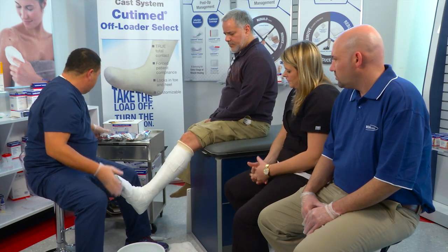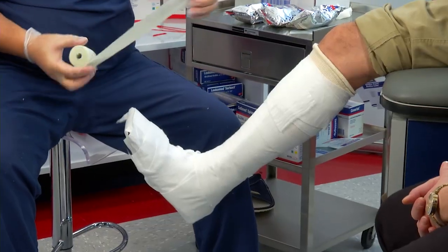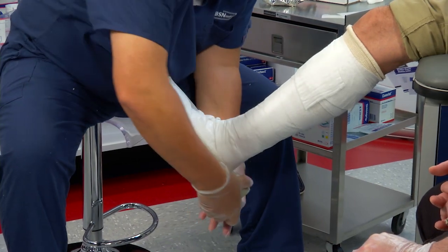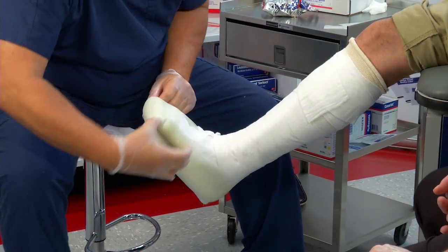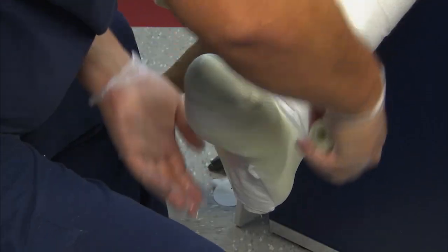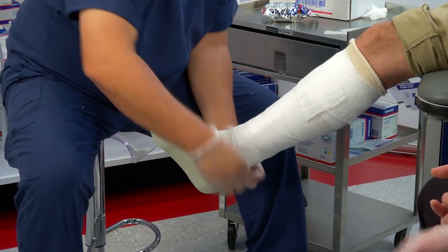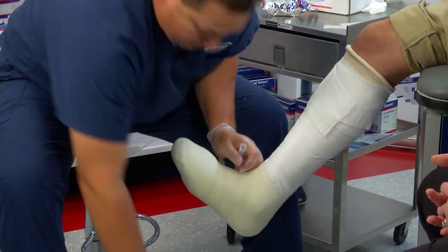When it comes to the cast tape, what separates this cast from other cast tapes on the market are the conformability and the stretchability of this tape. I'm just going to drop that in the water and apply this on, giving it some tension as I go — as long as my barrel is close to the body, I can give it tension. I'm going to go 50% overlap. I'm not going to figure eight around the ankle, just go right around it, staying on tape at 50% and keeping at 90 degrees.